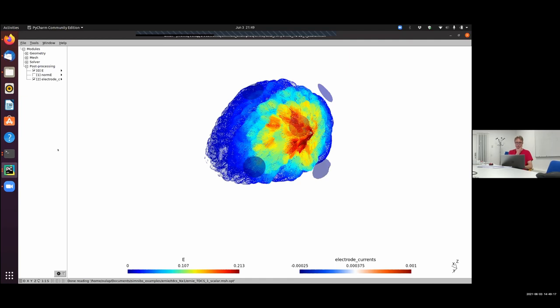Again, from another anonymous attendee: is there a way to perform single subject thresholding? Yes, in principle, that's exactly what SimNIBS gives out. It gives electric field strength, and you can then select some threshold of the electric field and see how much of the field in this particular subject is above this threshold. Or the other way around, you can extract the peak field from that subject to get a marker of how strongly I stimulated that subject. And that's a marker which I could then, for example, try to relate to some behavioral results. That is the information you get from these simulations.